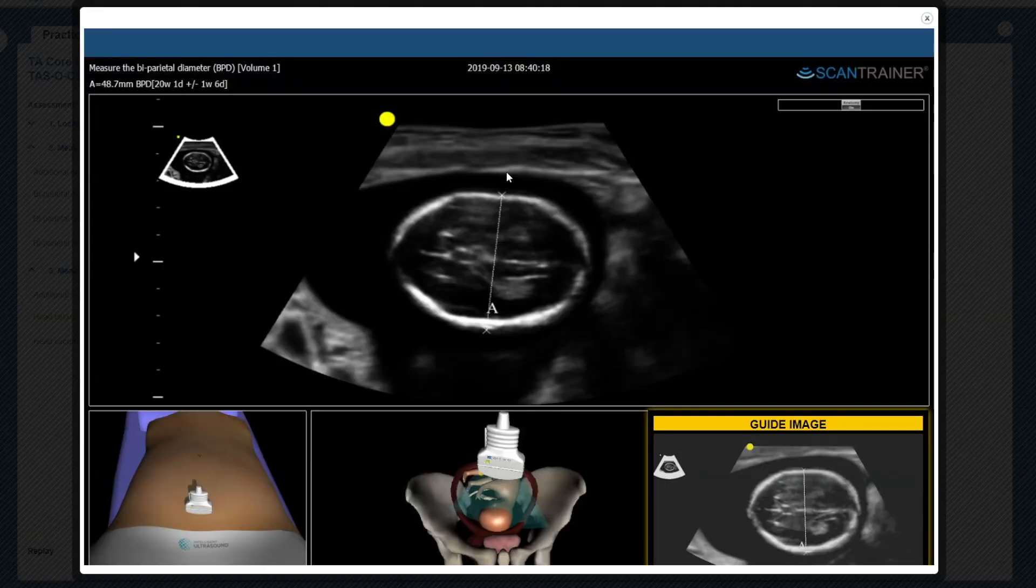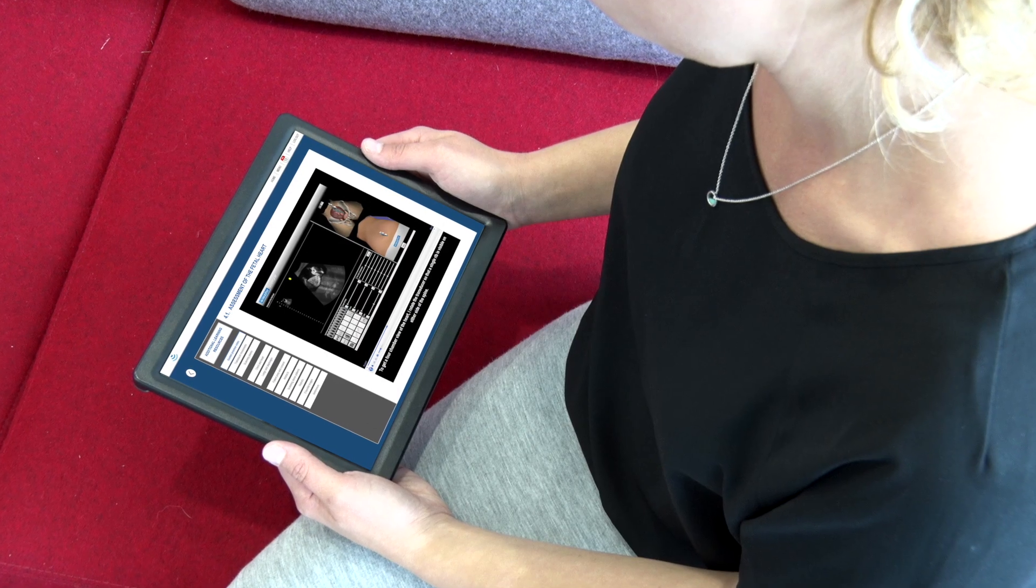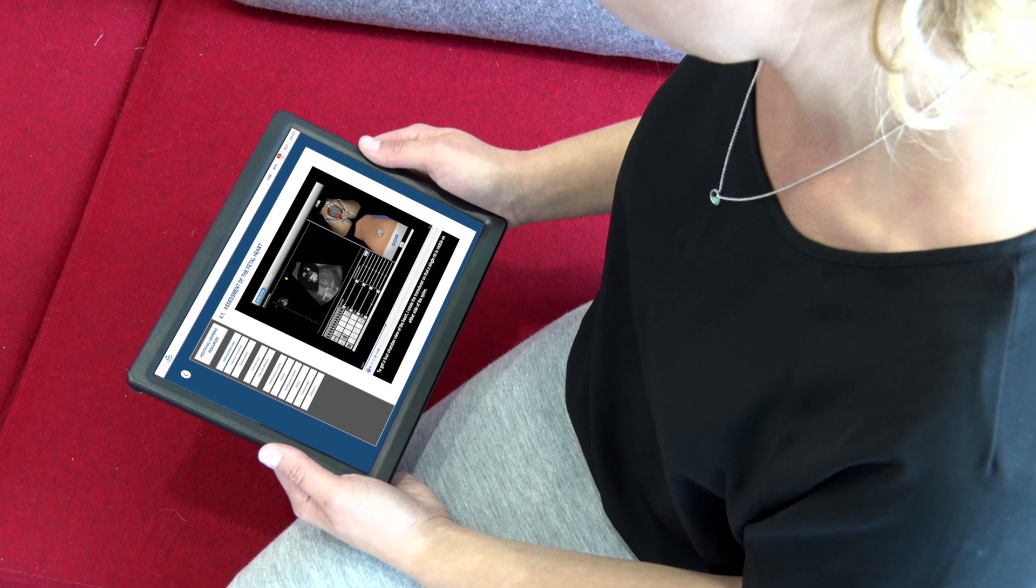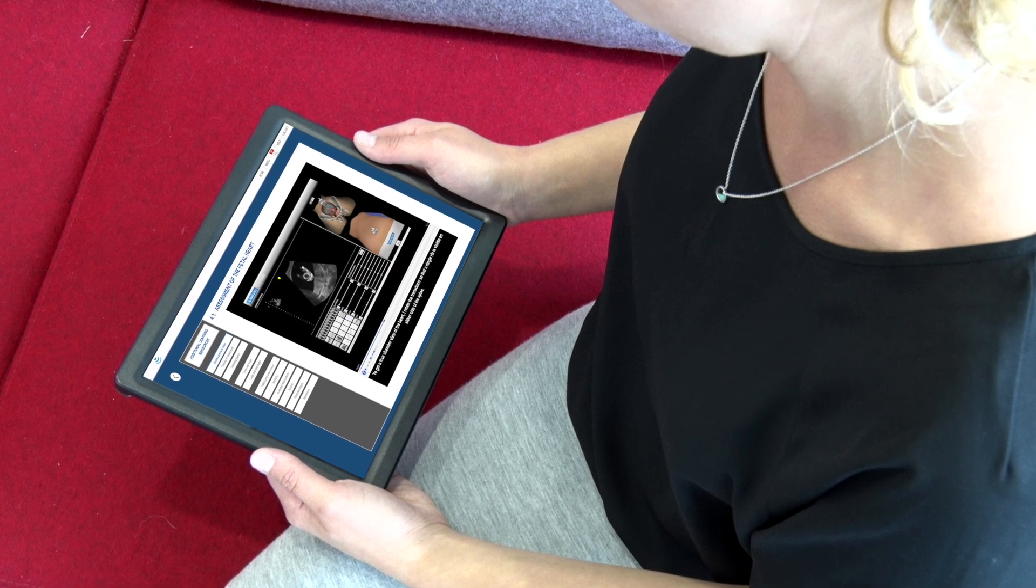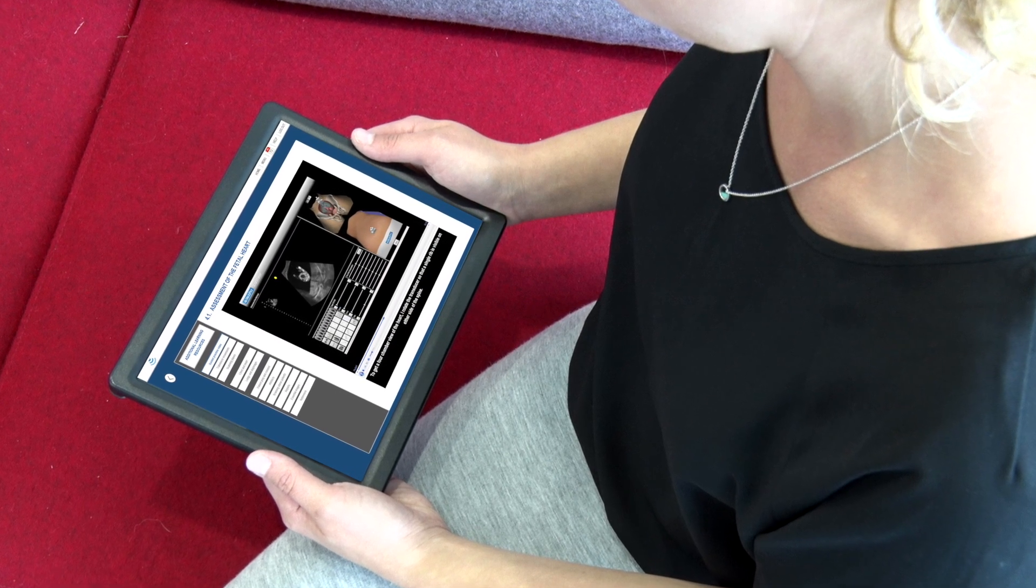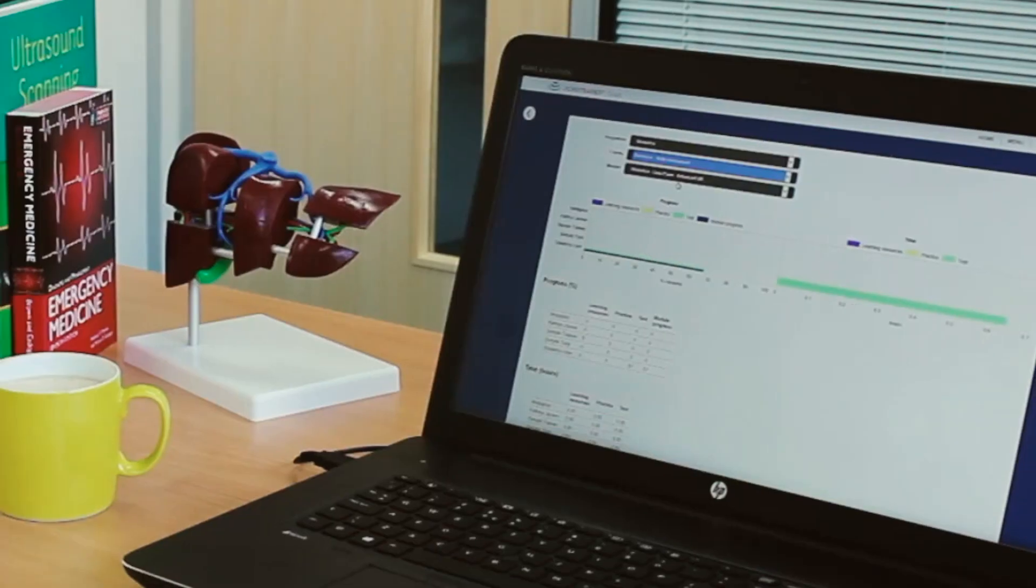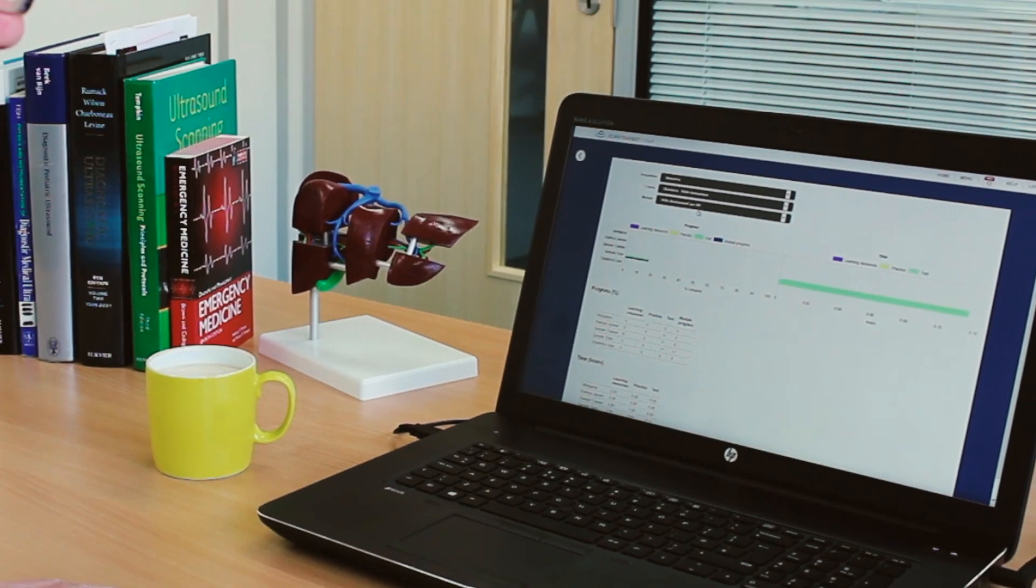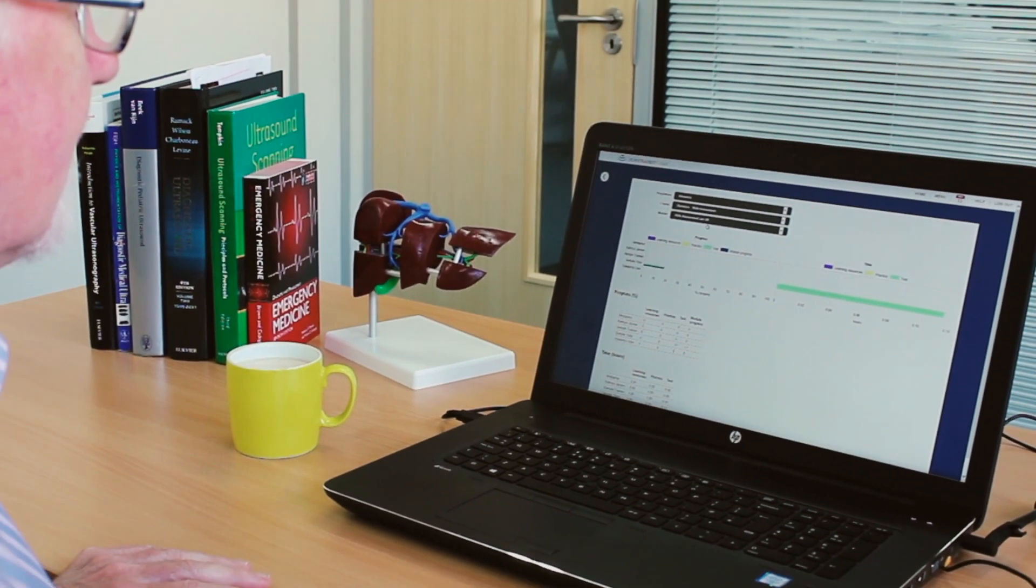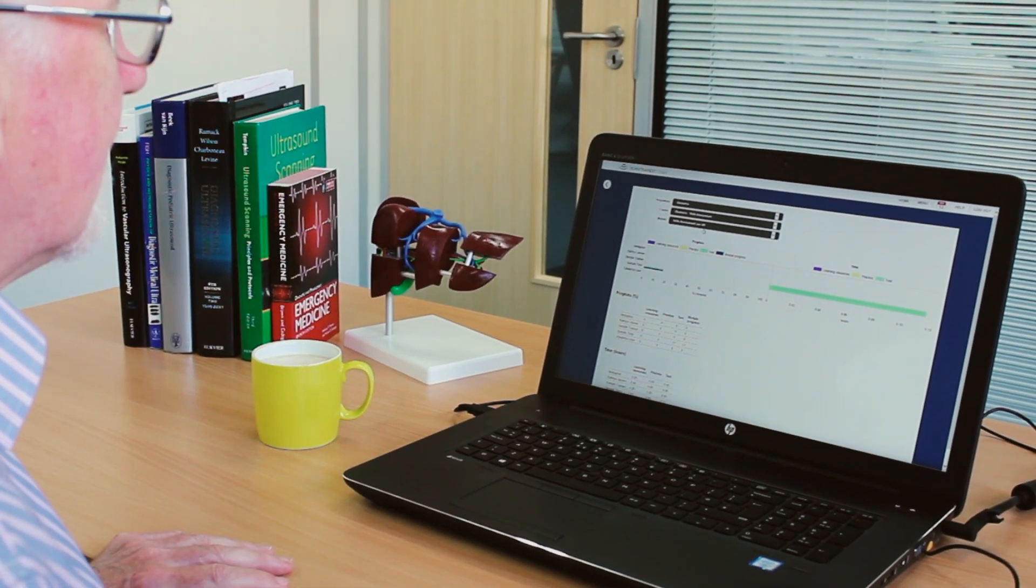ScanTrainer Cloud gives your trainees remote access to the system's extensive learning resources for pre-learning and revision. With remote access, tutors can set tasks and review trainees' progress at a time and place to suit them.